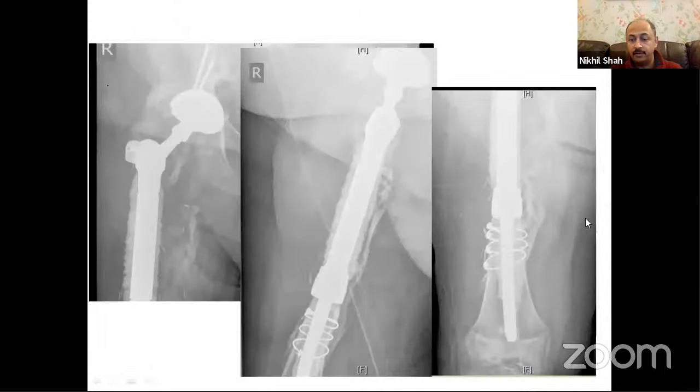So in this case, what we have done is a proximal femoral replacement using a megaprosthesis, fixing it in the distal fragment. But because the distal fragment also had intrafragmental comminution, we have used some cerclage to try and fix it and then cement it in. And then we coat the proximal fragment with cement loaded antibiotics, or you can have a silver coated prosthesis. And it has this little trochanteric plate.